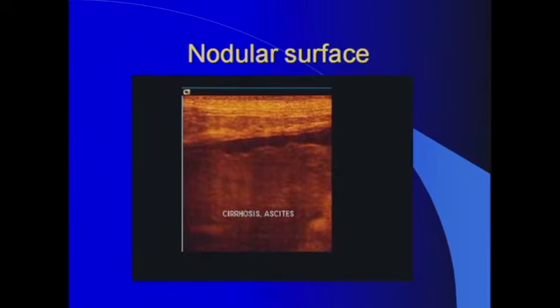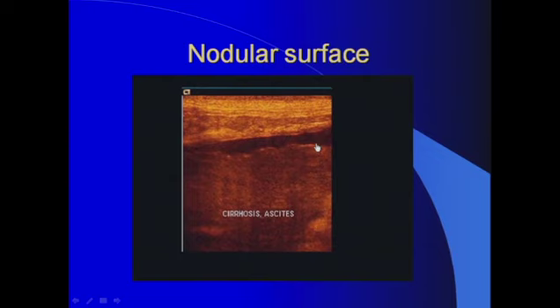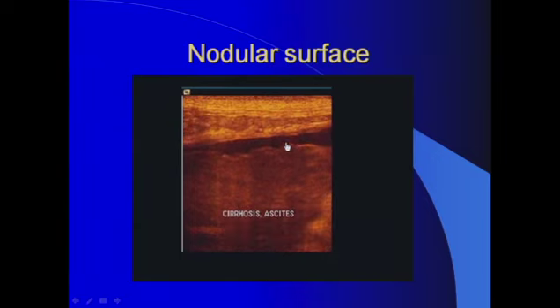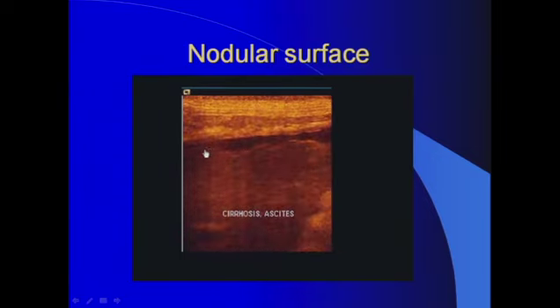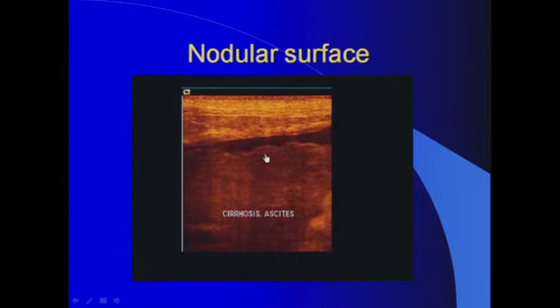This is a high-resolution ultrasound using a linear probe evaluating the left lobe of the liver. Now, this is a straightforward example because, in the presence of ascites, your specificity and sensitivity significantly improve. You can see how irregular this liver surface is, indicative of cirrhotic change in this patient with chronic hepatitis.